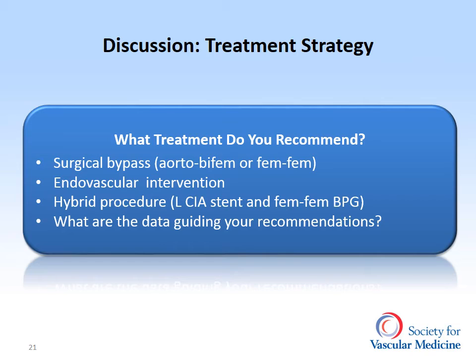There are no contemporary randomized trials evaluating the safety and durability of endovascular and surgical revascularization for aortoiliac disease. Some of the older data available are summarized in the following slides. The often quoted TASC 2 recommendations may serve as a general guide in such decision-making. However, the TASC 2 lesion classification may or may not apply to every clinical scenario, as comorbidities and operator experience weigh heavily in deciding whether surgical or endovascular therapy is selected.